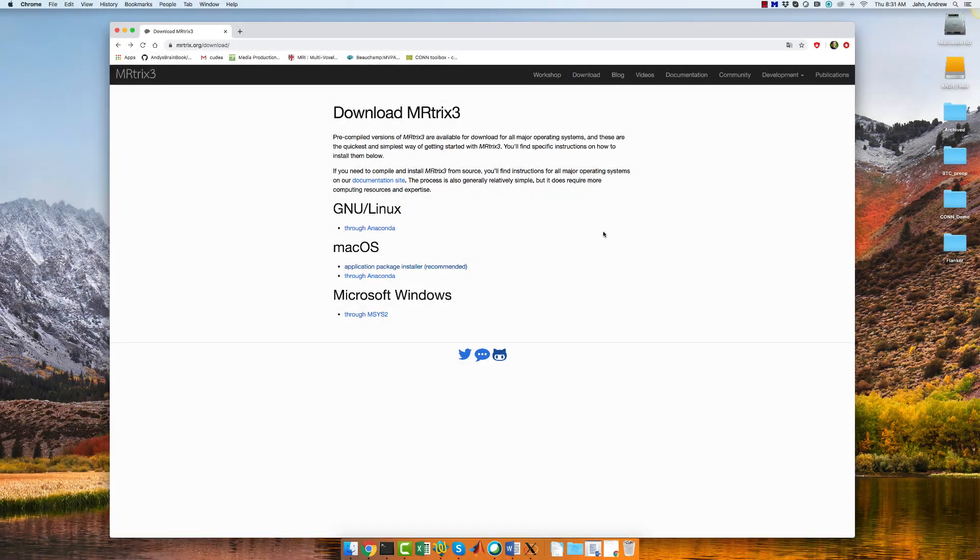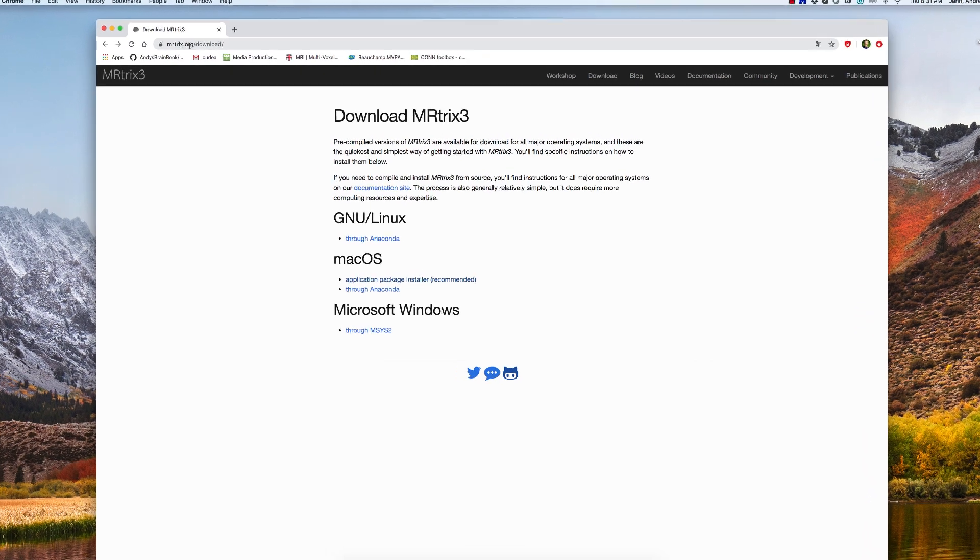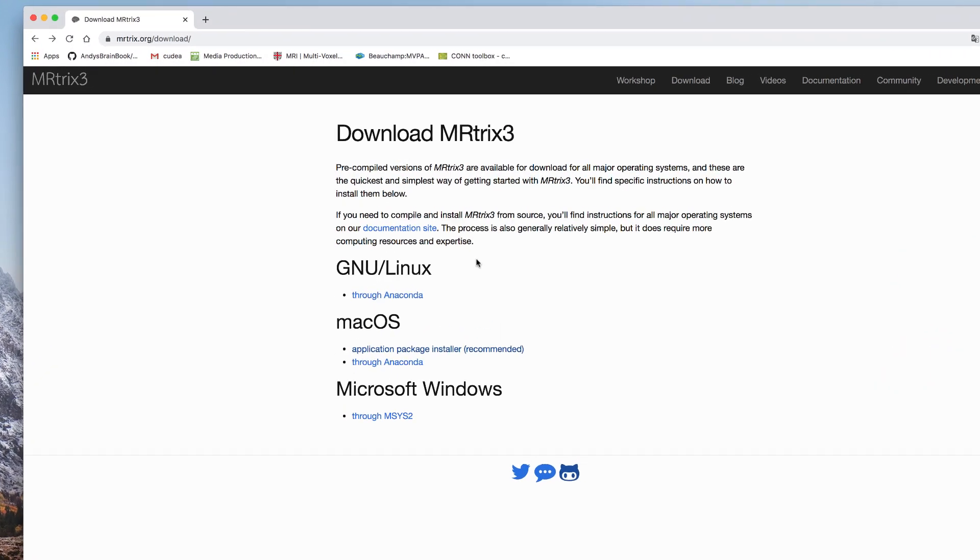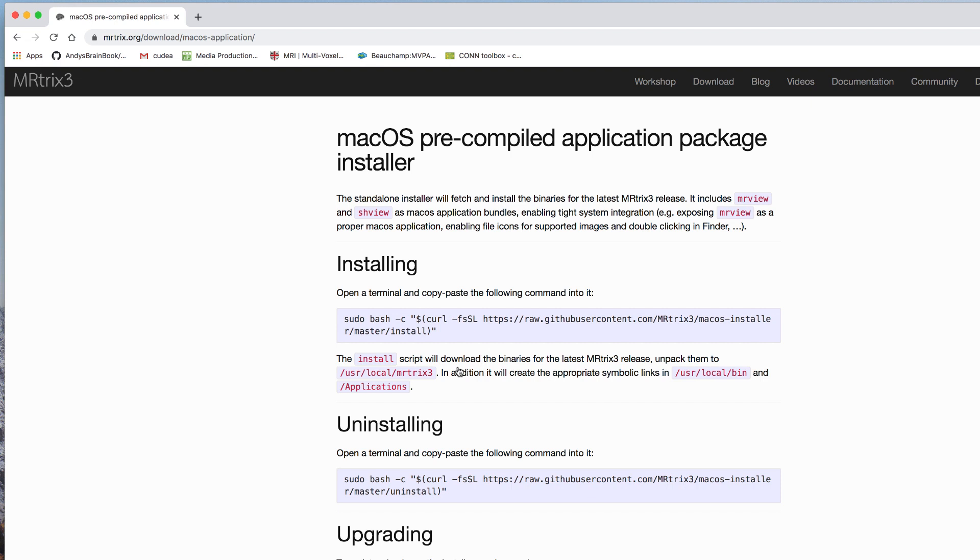To get started, we will first need to download the MR-TRIX package. The MR-TRIX download page, located here, contains download instructions for Windows, Macintosh, and Linux users. I'm using a Mac, so I'll click on the Macintosh link. All you need to do is copy the installation code.